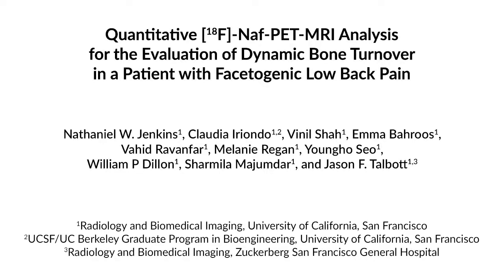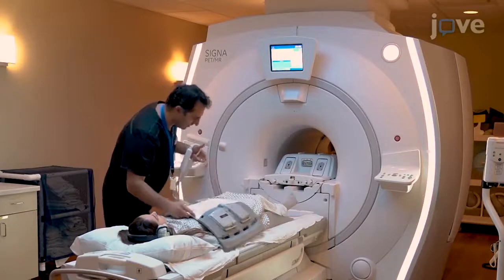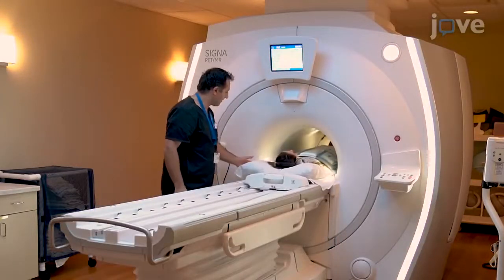With this technique, we use PET-MRI to identify physiologic biomarkers of bone turnover. We believe these physiologic biomarkers may more accurately reflect facet joint pathology than CT and MRI static images. We believe this technique may help us identify painful and symptomatic joints in the lumbar spine.